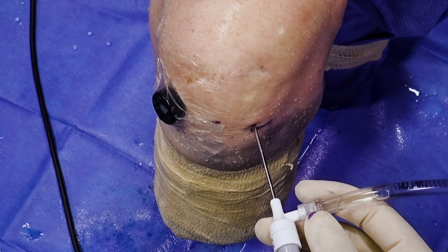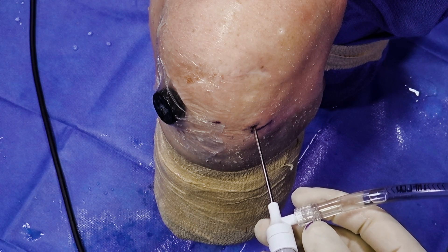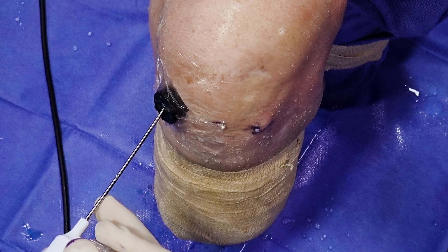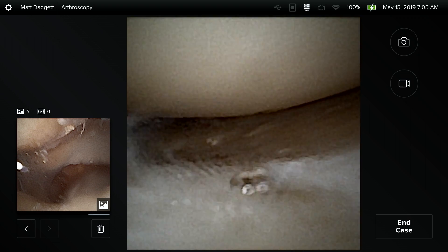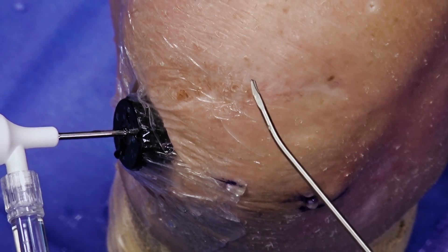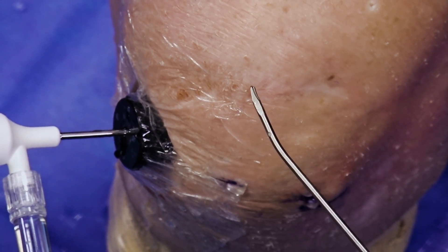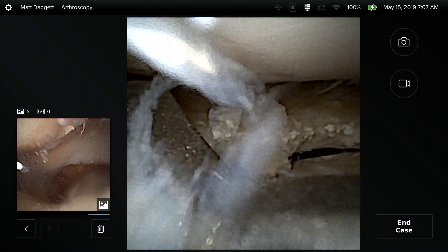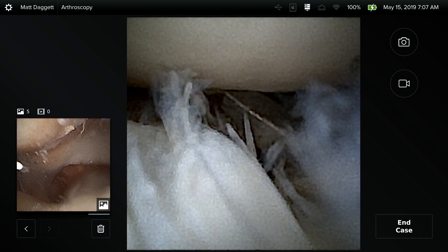Another helpful tip is that we can utilize the cannula already in place and insert our inflow cannula with nanoscope within that, without making any other portal sites. Thus, we've switched our visualization in a very efficient, patient-friendly manner. We can also use our upbiter percutaneously, which can be really beneficial in hard to reach meniscal pathology. The small size of this nano upbiter still allows us to get very efficient resection of these hard to reach meniscal tears.